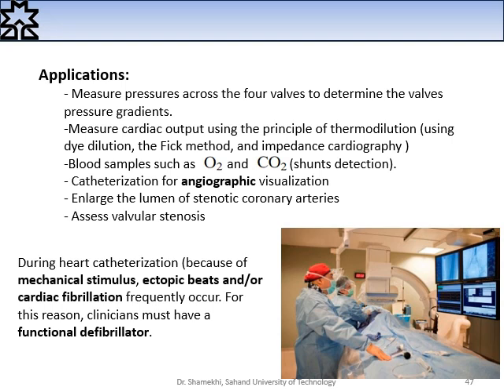Cardiac catheterization can be used to enlarge the lumen of stenotic coronary arteries, and also to assess valvular stenosis. Also, during heart catheterization, because of mechanical stimulation, some ectopic beats or cardiac fibrillation frequently occur. For this reason, a clinician must have a functional defibrillator for emergency use.